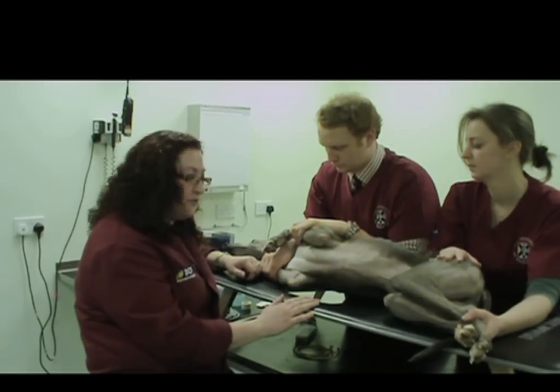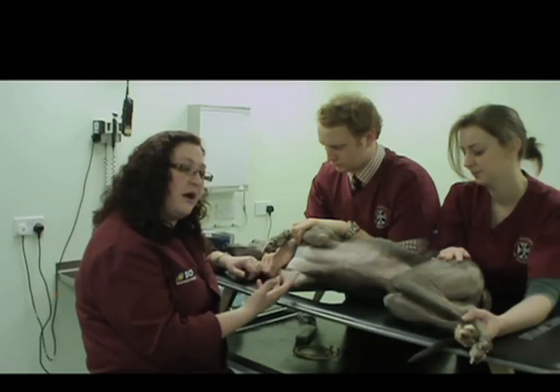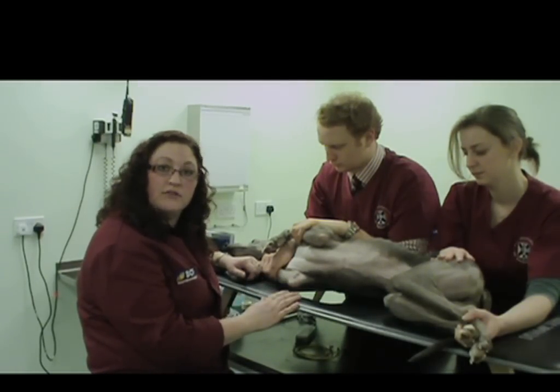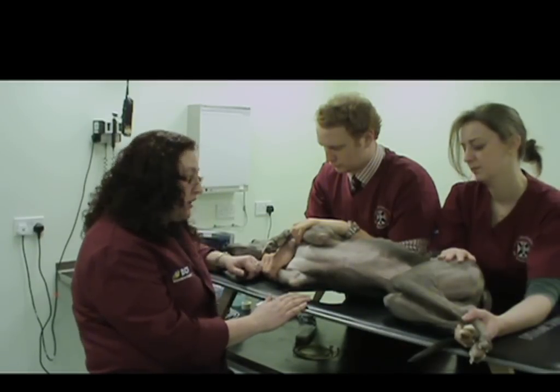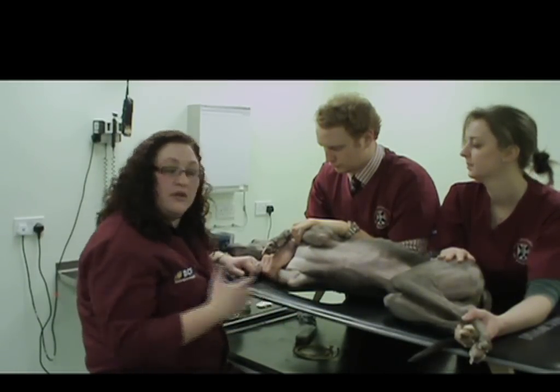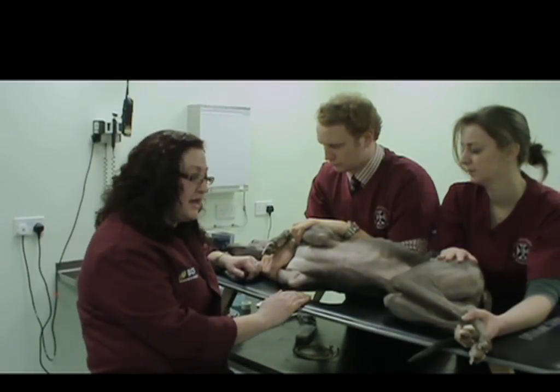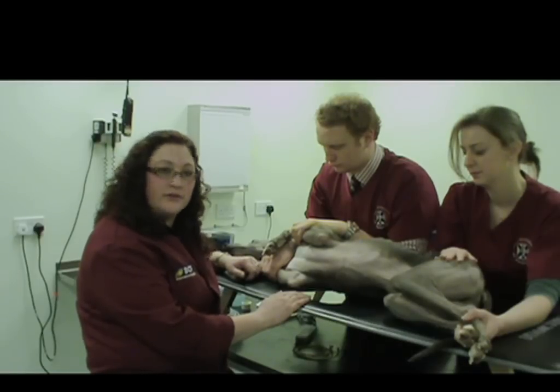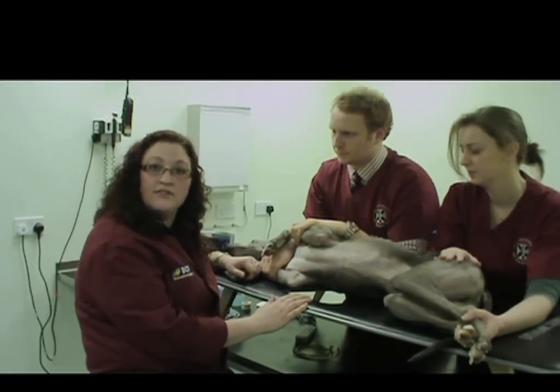This doesn't replace referral, and if there is a patient that you're concerned about that needs to have a veterinary cardiologist have a look at it, obviously that's the route that we should take. Also, if the client is requesting an echo referral, that is something that we should always take seriously. But this will give you a few of the skills necessary to get started.